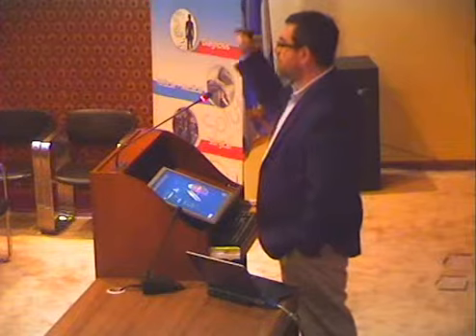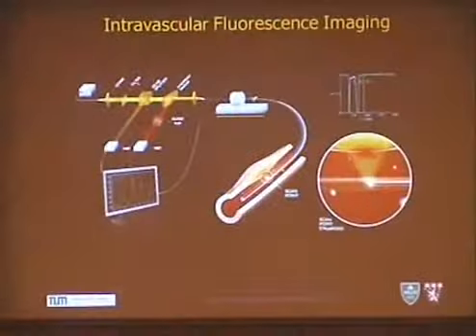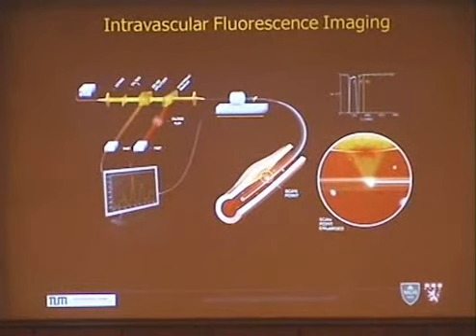And we're already developing this in collaboration with my former institution at Harvard and MGH. We are also developing a rotating system to image hollow organs, so not just doing front imaging endoscopy like with laparoscopy, for example, but also being able to go through hollow organs like the colon or blood vessels, and by pulling down a rotating system that does both fluorescence and optoacoustics, generate three-dimensional images. It's like the ultrasound that the previous speaker showed, but with optical contrast, essentially.